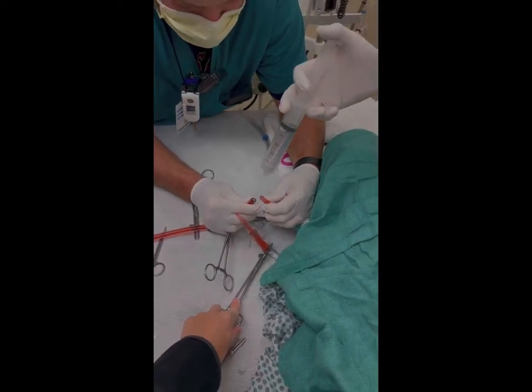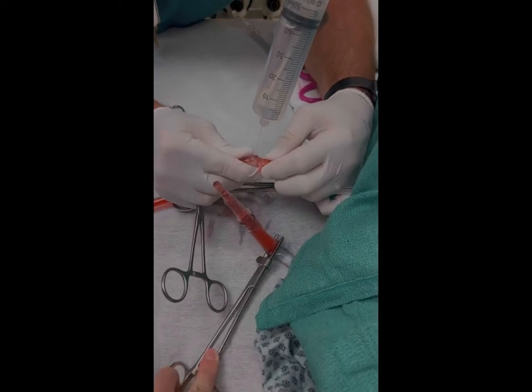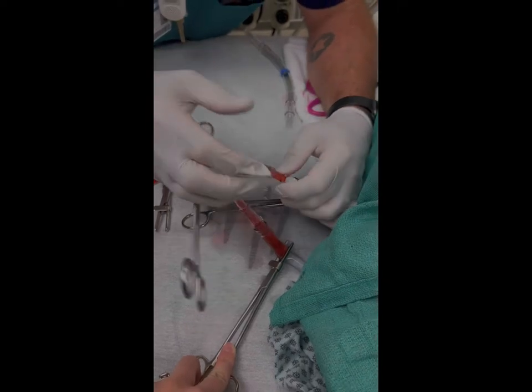In this video we're going to learn how to fill the cannulas during a circuit change. You're going to have the filler give a steady stream of saline and you're going to make your connection. Make sure that there's no air.